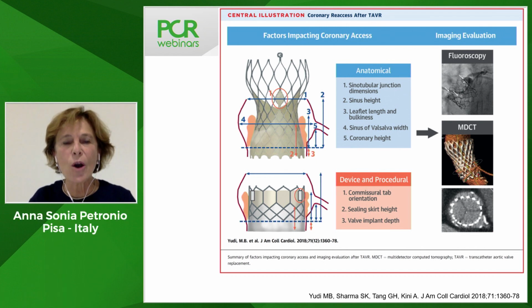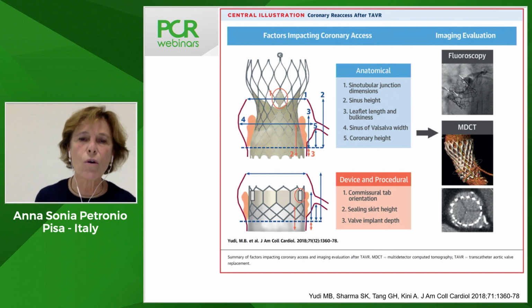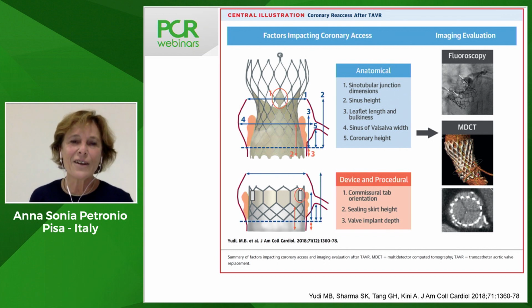Absolutely. So let's go into detail on your case. Before showing what you have done, when you have to perform a PCI or an angio in a patient who comes with a non-STEMI, like your patient, what kind of access do you choose? Do you perform an angiography, an aortography, beforehand to look exactly? What is your experience and what would you like to say to all the people who are listening to you?